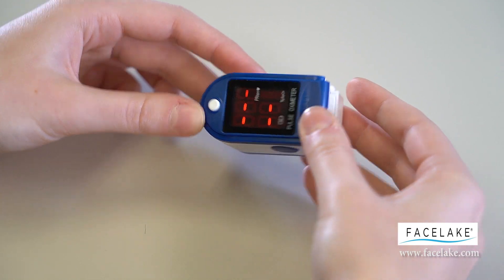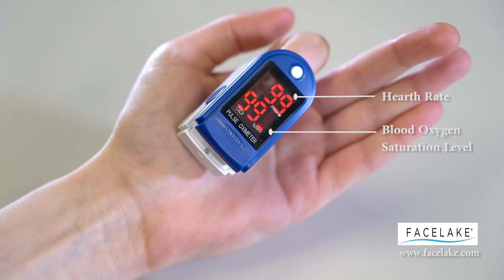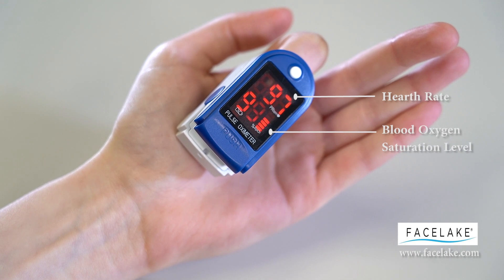Hold the unit with your fingers in towards you as so. The first number represents heart rate, and the second is the SpO2.